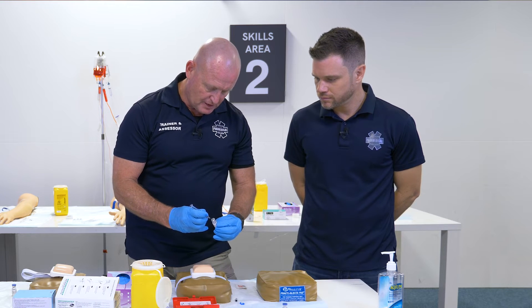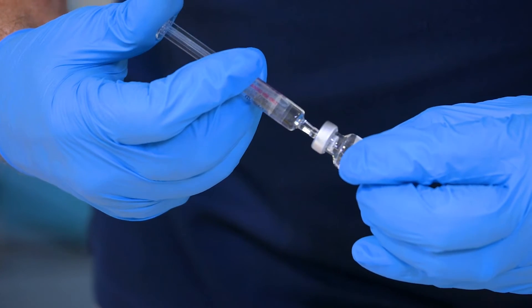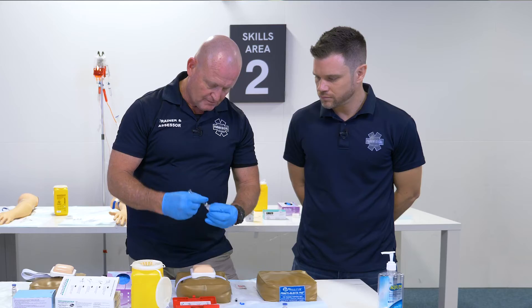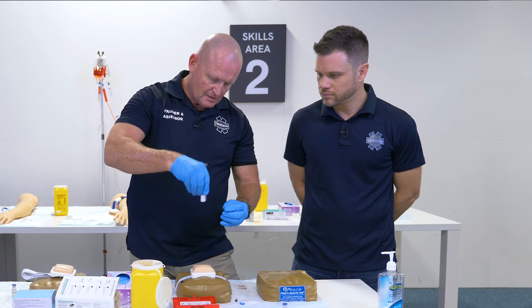Insert it through here. Be very careful. Squirt that out. Give it a twirl — shake it up.